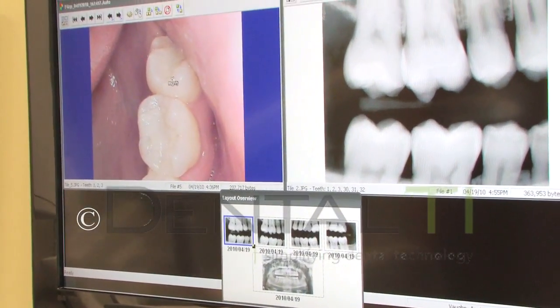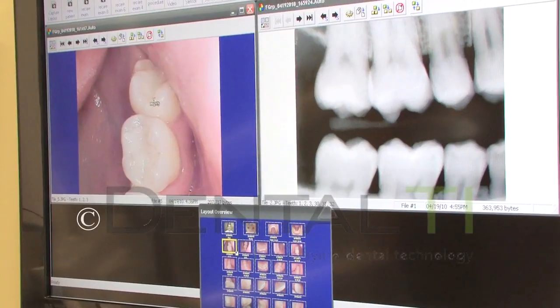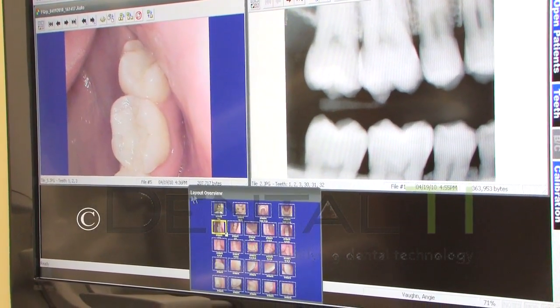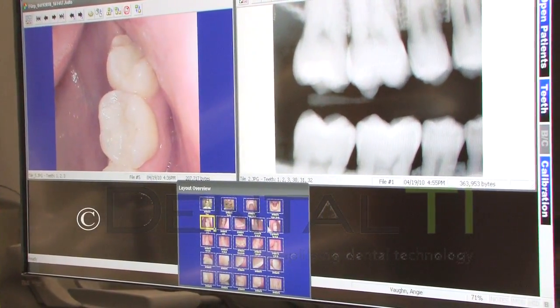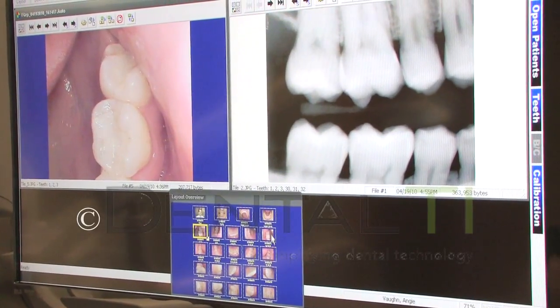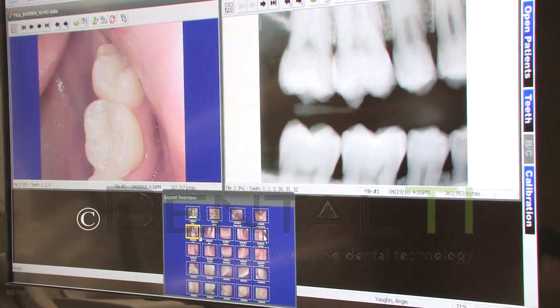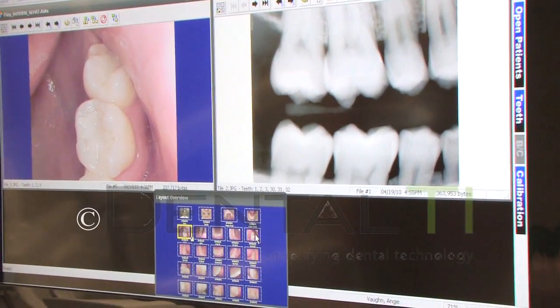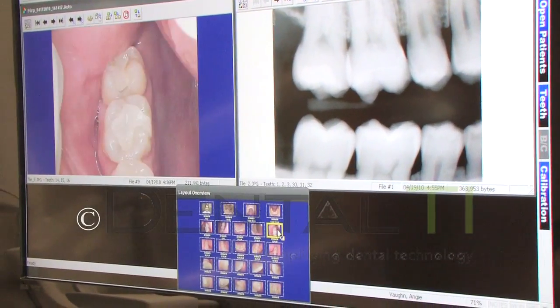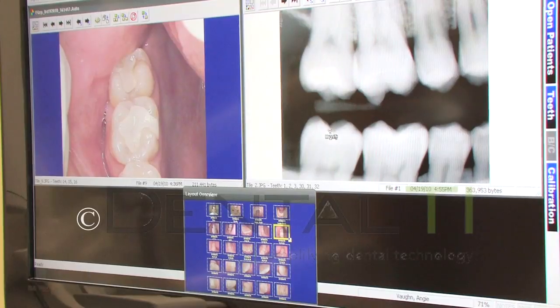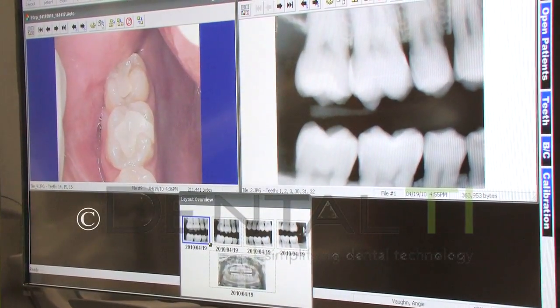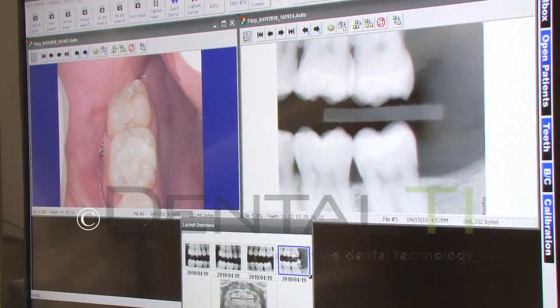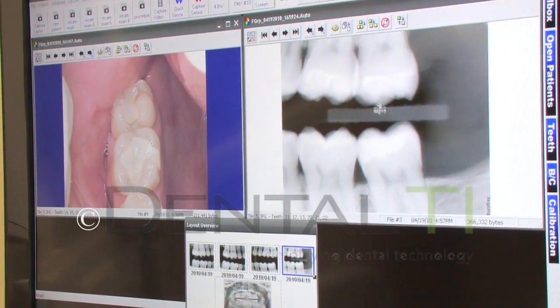Notice when I click on the layout or on the single image on the left side, the layout overview changes to the layout overview for the camera. So if I wanted to choose the image corresponding to the upper left of the patient's mouth, I could click that tile, then click over here — the layout changes to x-ray — and choose the corresponding x-ray for that area.